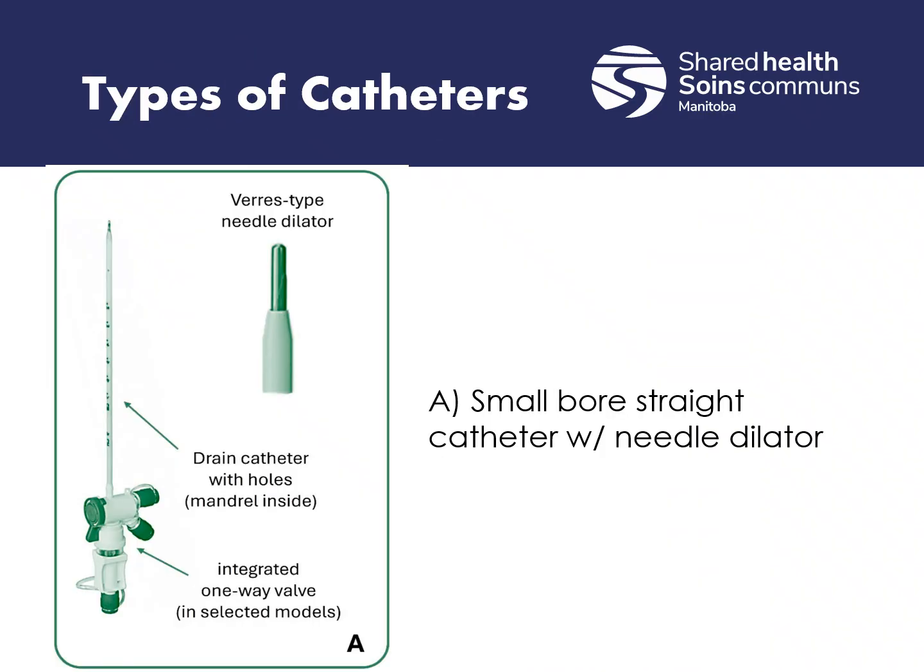When we talk about chest tubes themselves, there are different kinds. They're also known as interpleural drains, though more commonly referred to as a chest tube. Again, these are used to evacuate air, blood, or anything else from the chest. There are a couple of different kinds here. The decision to use large bore or small bore, for EMS, is not something we're concerned with. We're not the ones doing the chest tubes at this time.